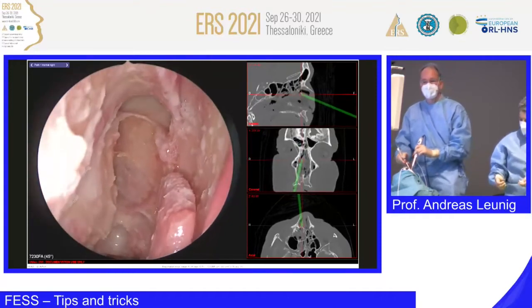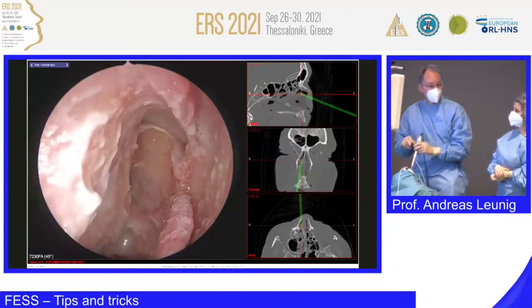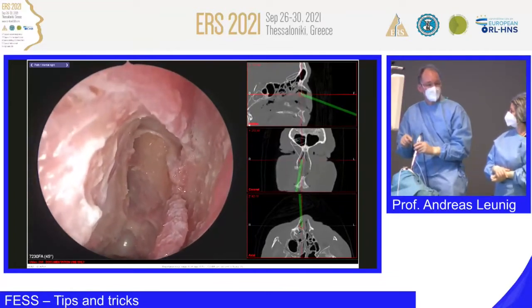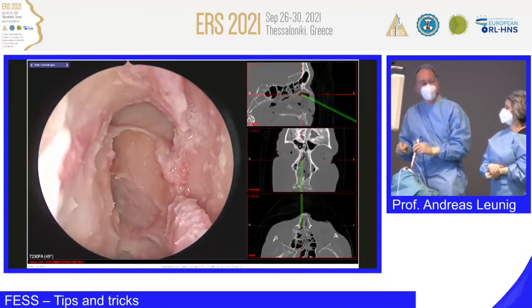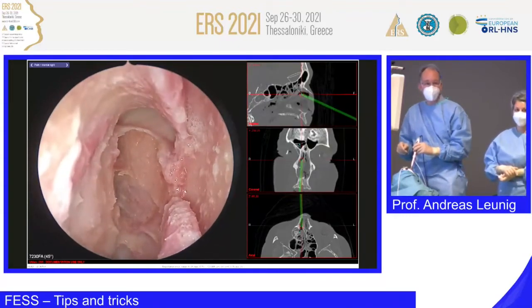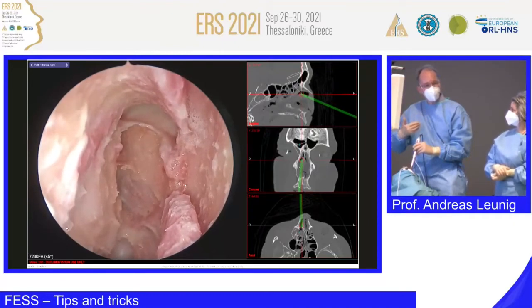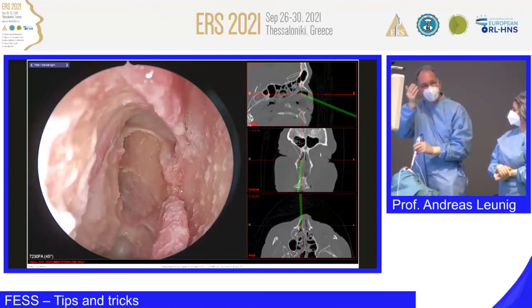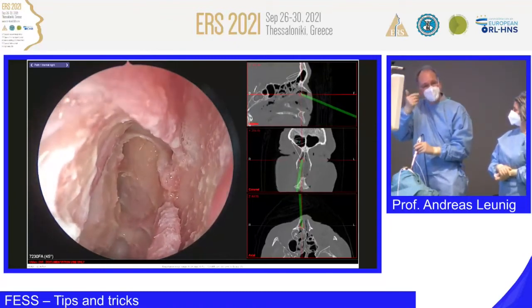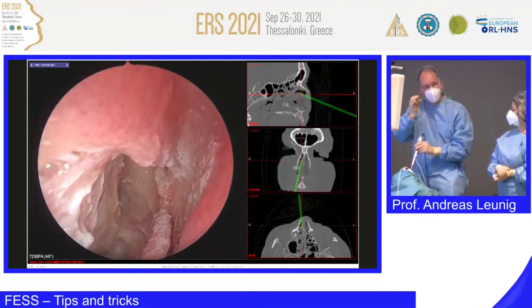Okay, yes, that's a very good question. It's up to your preparation. When you do a circular traumatization of the mucosa, the risk of restenosis is quite high. So my recommendation is to follow the principles of the School of Graz and dissect the bony lamellas very gently, leaving as much as possible, but look for the drainage pathway.